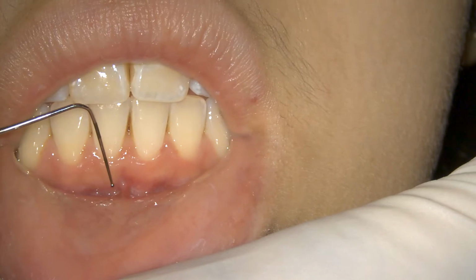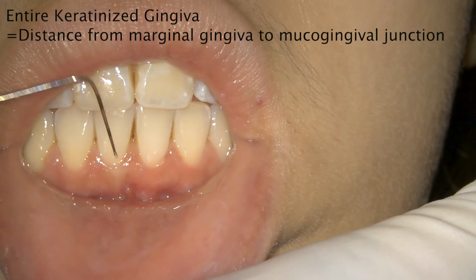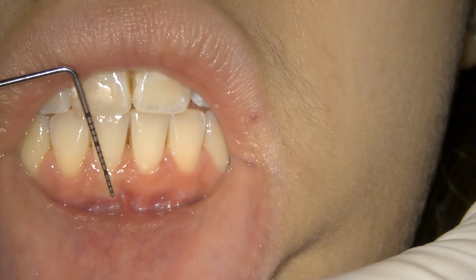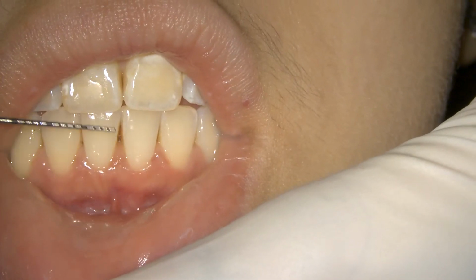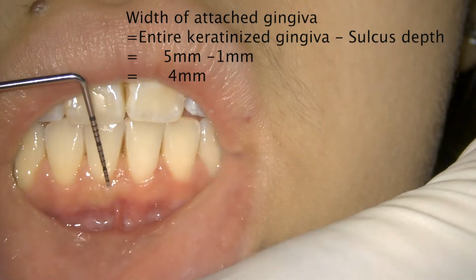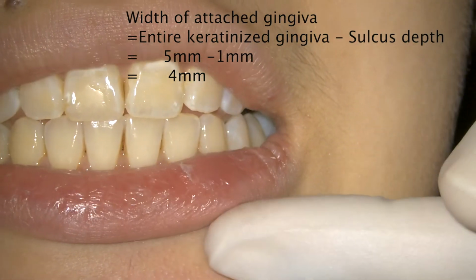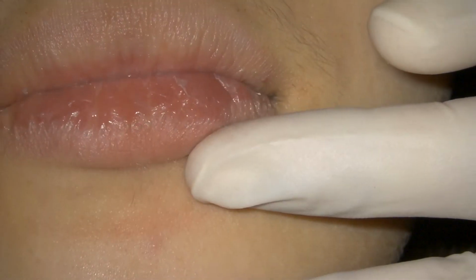So, if you are measuring the entire keratinized gingiva, it is from the crest of the marginal gingiva until the mucogingival junction. If you want to measure this, this is the marginal gingiva and this is the mucogingival junction. It stands at roughly around 5 mm. From this 5 mm, if you want to calculate the width of attached gingiva, you have to subtract the sulcus depth. How much is the sulcus depth in this case? It looks around 1 mm. So there is around 4 mm of width of attached gingiva. This is one aspect of measuring the width of attached gingiva clinically in a patient.